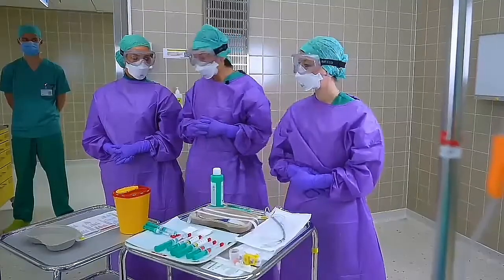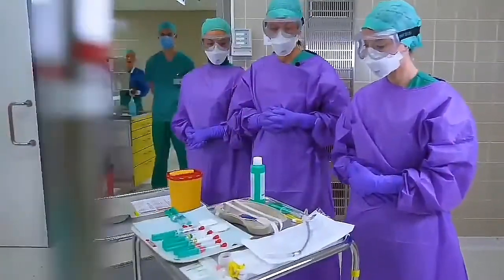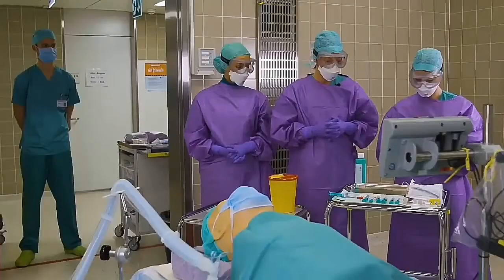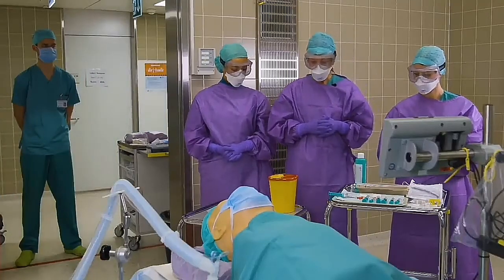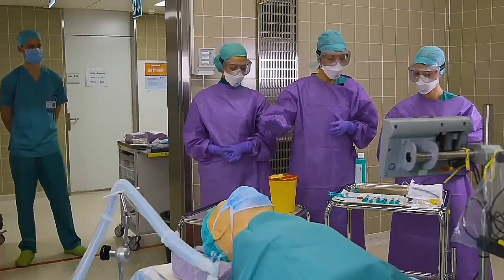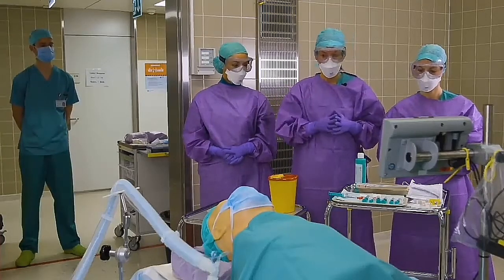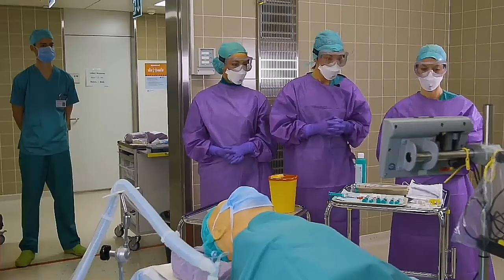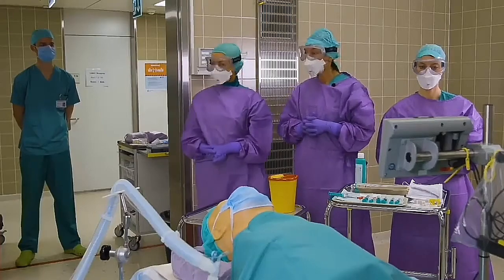For induction, we have our medications on the tray, as well as our airway materials, including an endotracheal tube with a stylet in place, as well as our video laryngoscope. Next to the induction table, we have our dirty tray for dirty materials to be disposed there. It's also important to have a trash bin next to the patient so you can drop dirty articles right into the trash bin. Outside we have Tim, who is our clean person and jumper. In case we need medications or airway material, he will be able to hand them to us.